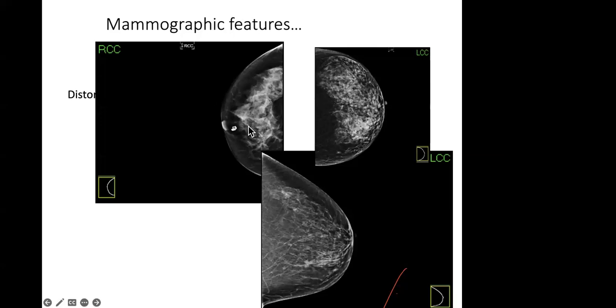To summarize mammographic features: masses, calcifications, asymmetry, and architectural distortion. We also look at the skin around the mammogram. When looking at architectural distortion on the mammogram, you can see the structure looks a bit dodgy in one area. There is also asymmetry — when you see everything looking the same on one side but slightly different in another area, that's what you're comparing.